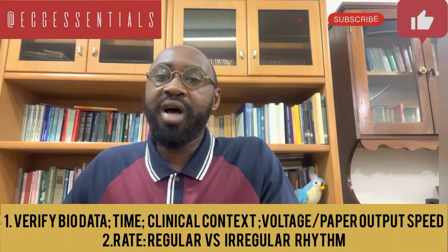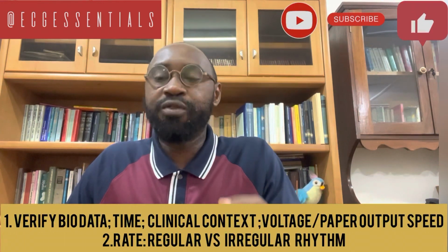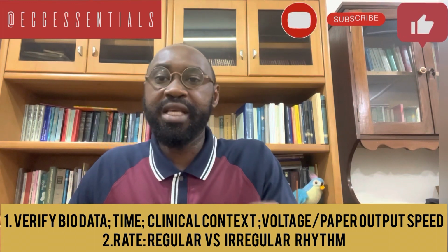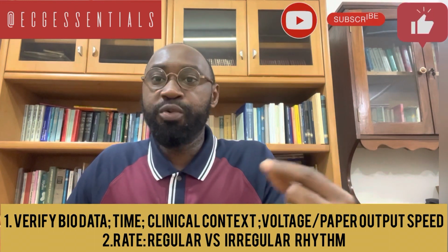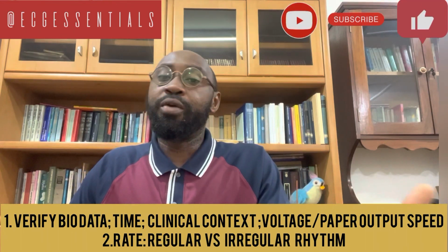After we have verified the biodata of the individual, the next thing we look at on the ECG is the rate at which the heart beats. And the normal, as we all know, is 60 to 100, 60 beats per minute to 100 beats per minute. And so bradycardia will be below 60, tachycardia will be beyond 100.